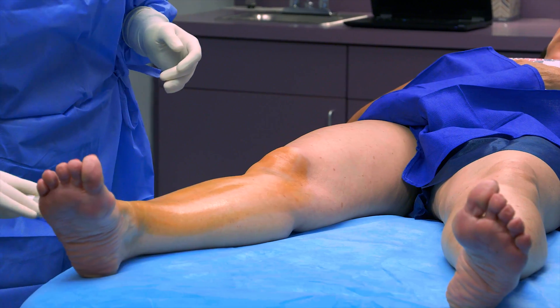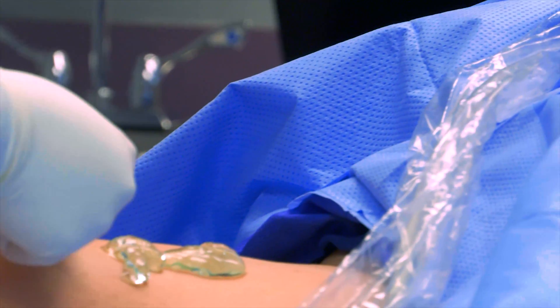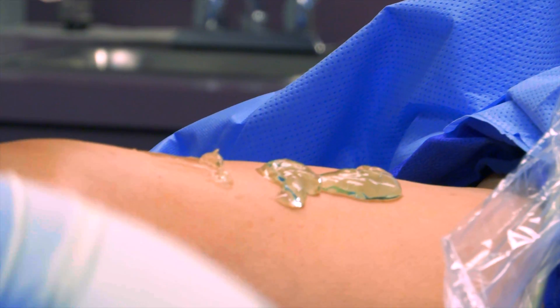The leg to be treated will be cleansed and draped for the procedure. Your leg will be positioned, ultrasound gel will be placed on your leg, and the vein to be treated will be confirmed by ultrasound.